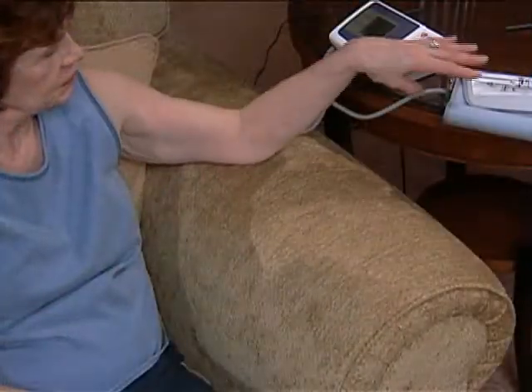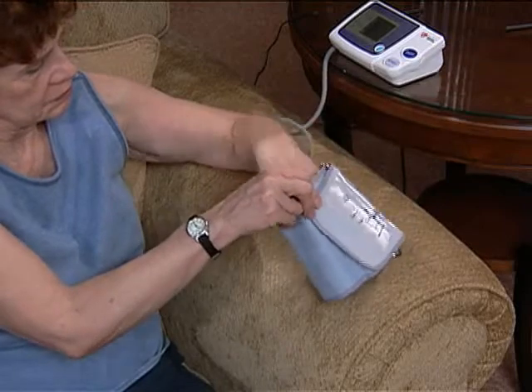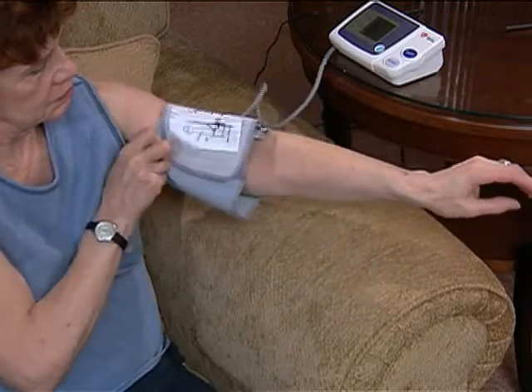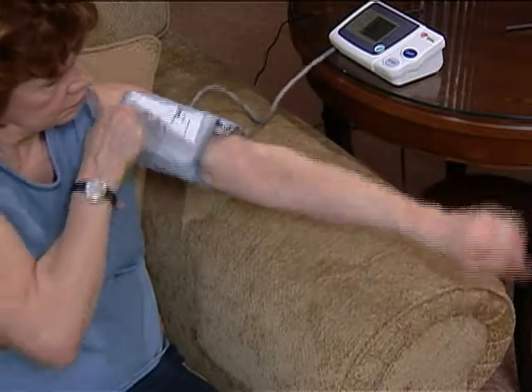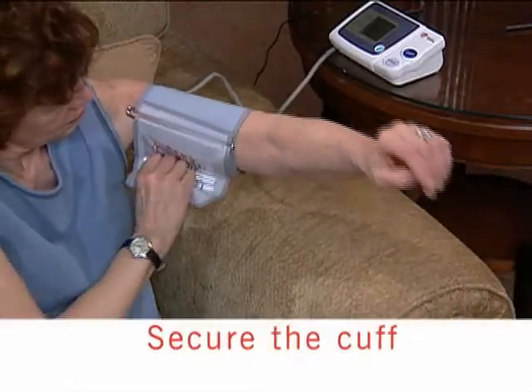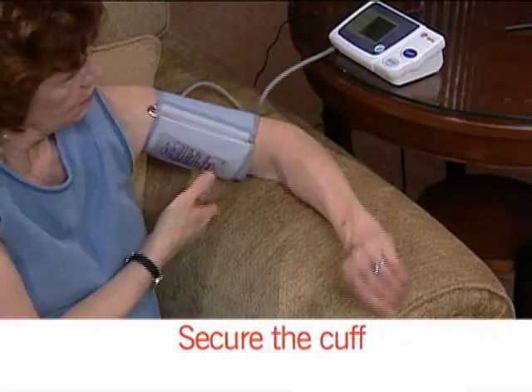If you are unable to locate your pulse, you can still measure your blood pressure. Place the arm cuff of the blood pressure monitor slightly above the bend in your elbow. Next, slide the blood pressure cuff onto your arm. You may need to roll up your sleeve. The lower edge of the cuff should be about 1 inch above the bend of your elbow. Use the Velcro wrap to make the cuff snug, but not too tight.